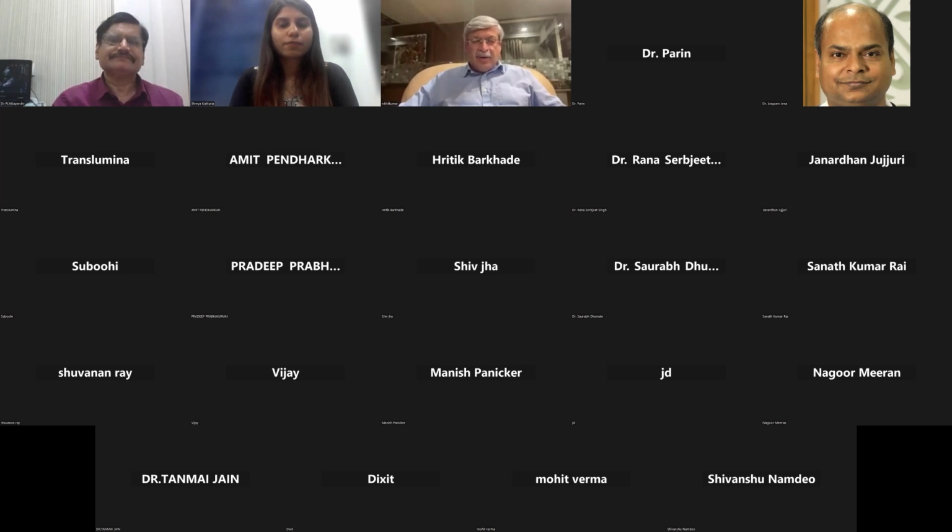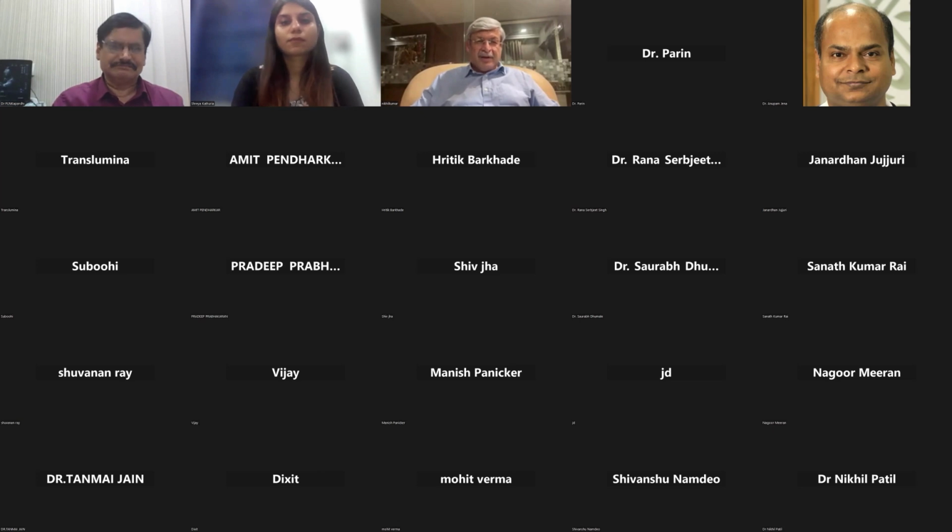I really do not have any major stent choice. I think plaque modification is more important than the stent choice. If I see calcium, we've grown up in the time of rotablation, and I would have gone in this case with probably a 1.75 burr right to start with. We've been doing even radial interventions. I've in fact recently used a 1.75 burr using a radial intervention. So we have good hardware available now, so we can do that.